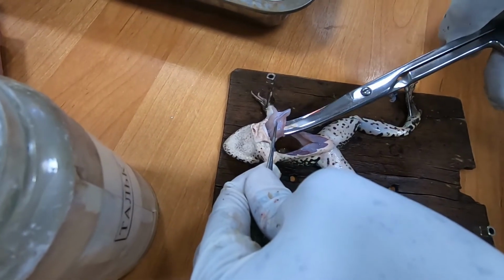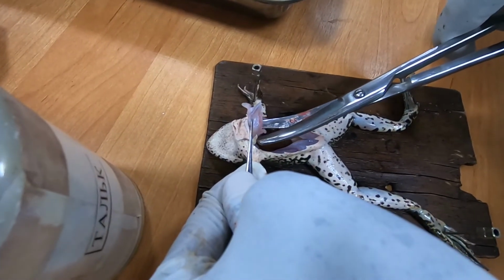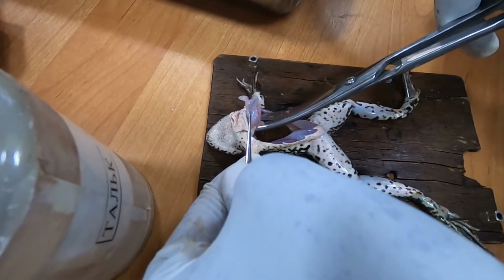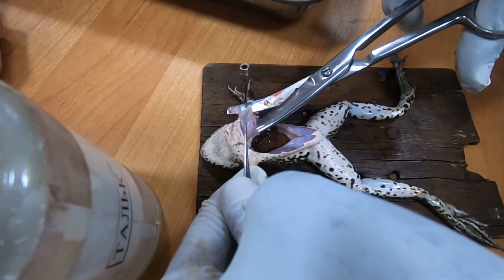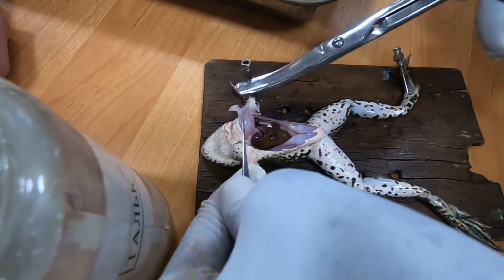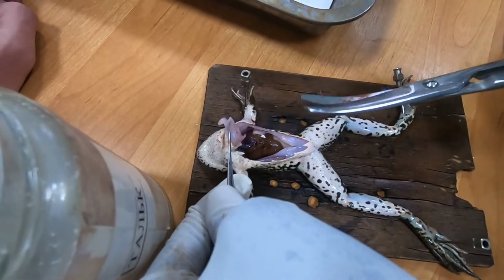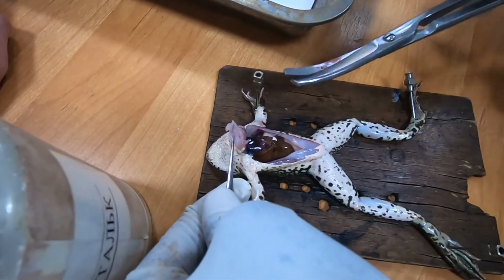We're exposing the heart from the pericardium, as we did during ECG, electrocardiogram.